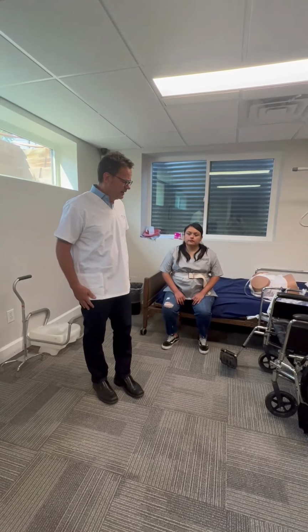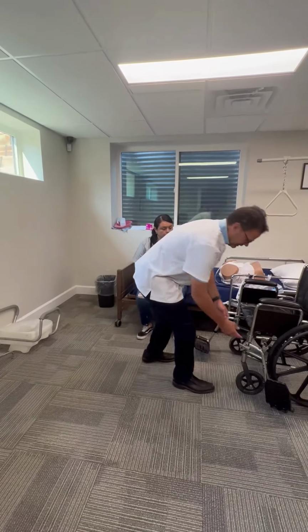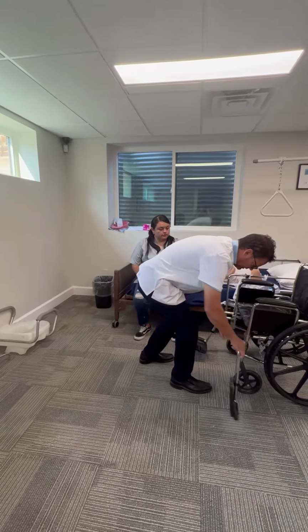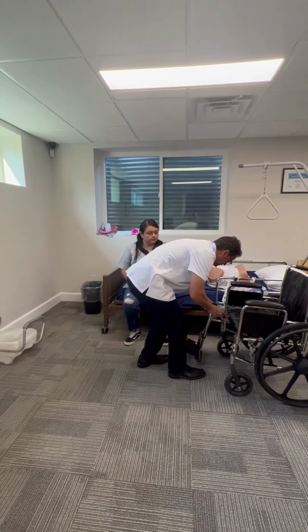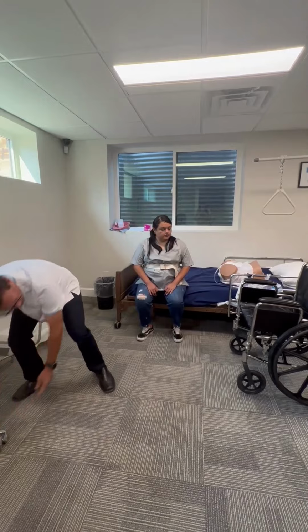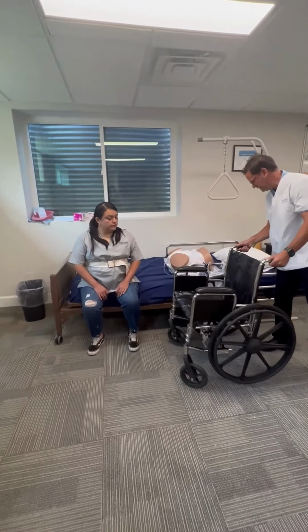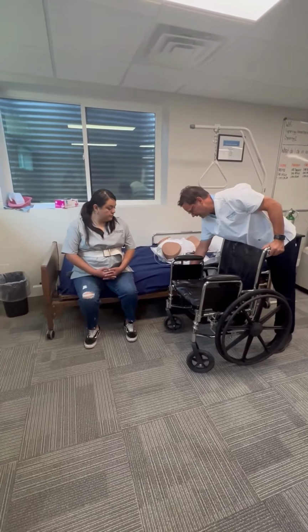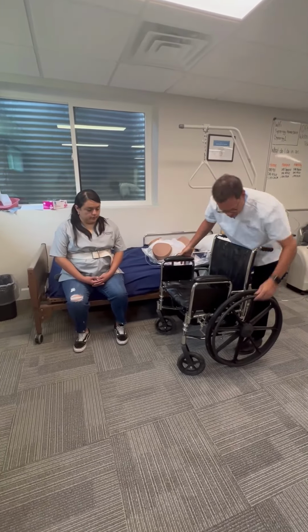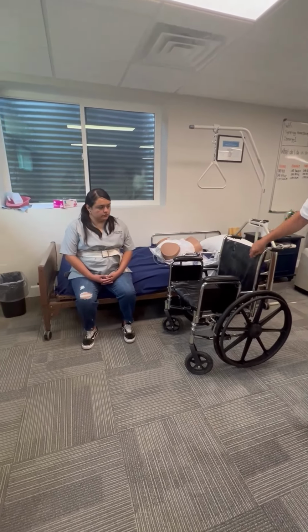So let me get the setup here. I am going to use a wheelchair, and I'm going to take off the stirrups and put them to the side for now. And again, the chair is going to be positioned closely. I am going to be locking the wheels to secure the chair, and now the chair is ready.